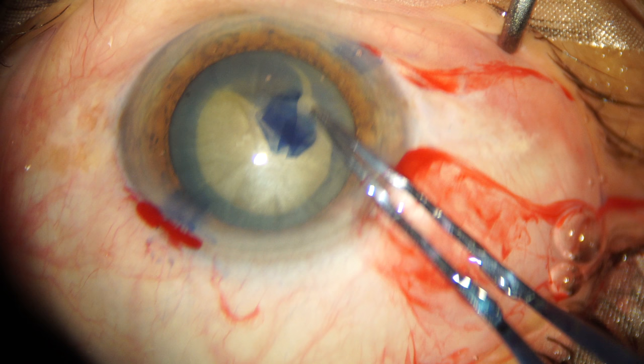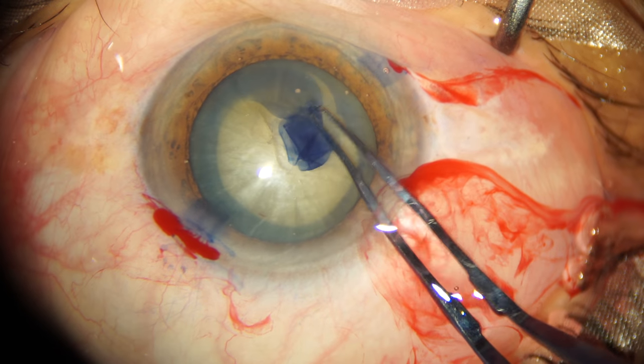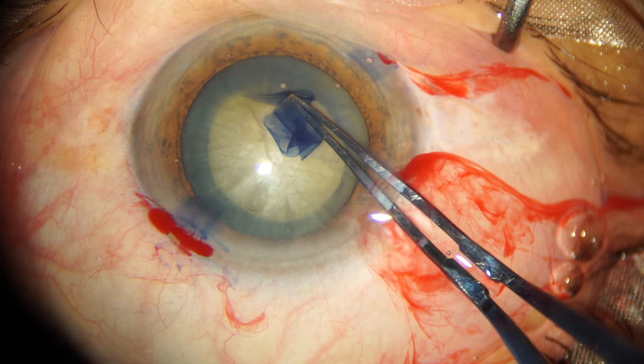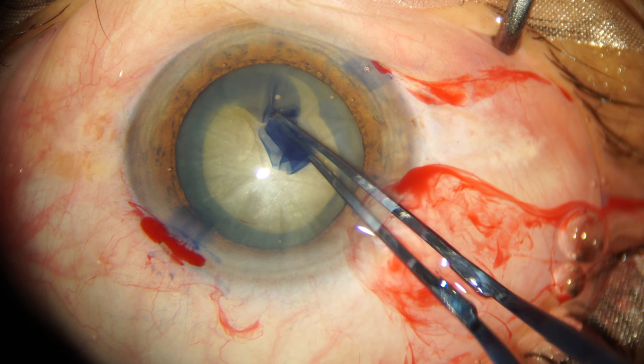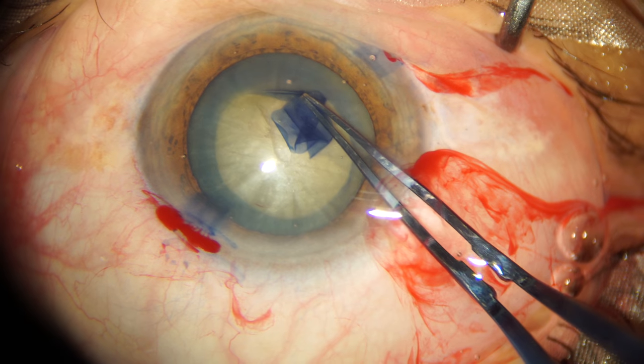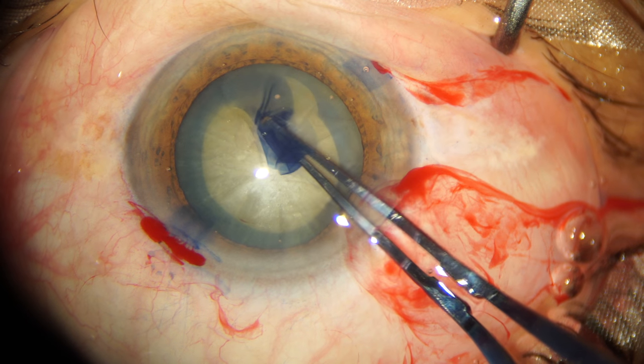And boom — I've had a radial extension of the capsular rhexis margin. Let's see that again in slow motion. You can see that the mistake I made was that I grasped the capsular flap quite far away from the tearing edge and lost control. In my confidence that I had nearly completed my capsular rhexis, I grasped it in the wrong manner.